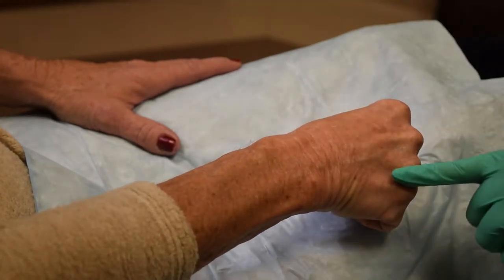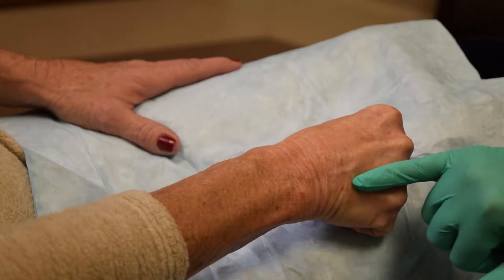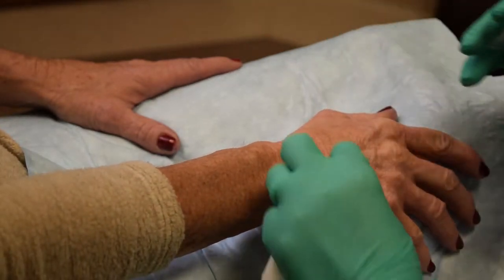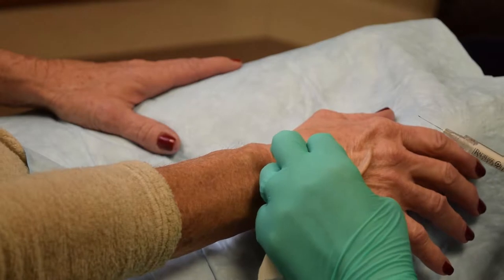For the first demonstration, we'll utilize the 27-gauge needle included with the product. Initially, I will inject the first, second, and third intermetacarpal spaces. To avoid injection into vessels and tendons, I will deliver small boluses of 0.2 to 0.5 cc between the superficial fascia and dermis.